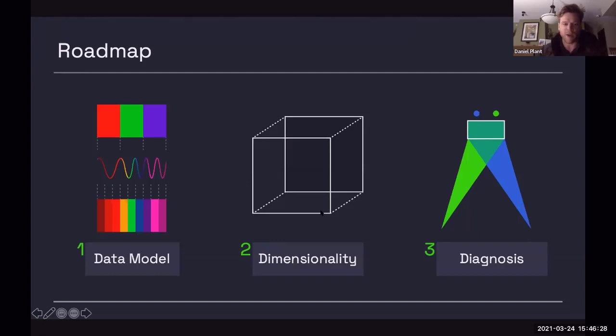So we want to serve applications where there's very high throughput, a lot of patients coming through, but also a lot of data on an individual patient, because comparing pixels from patient A to patient B can be very challenging because of the dimensionality issues that we mentioned. So having patients come through on a regular basis and comparing pixels of the evolution of their skin within a patient over time is very important.